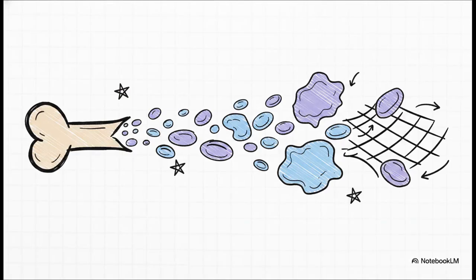Wrapping up our glossary, we have the thrombogram. Now, we all know platelets are in charge of primary blood clotting, right? But here is a really cool advanced clinical tip for you. Do not ignore the MPV. That's mean platelet volume, and the PDW, platelet distribution width. A high MPV paired with a high PDW heavily supports active bone marrow regeneration. It basically tells us that giant macroplatelets are mixing in with the normal-sized ones because the marrow is just working overtime to replace platelets that are being rapidly destroyed out in the periphery.